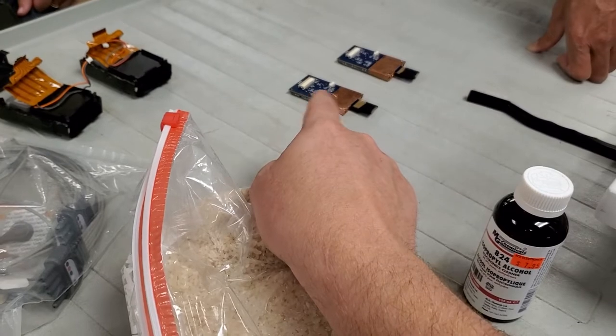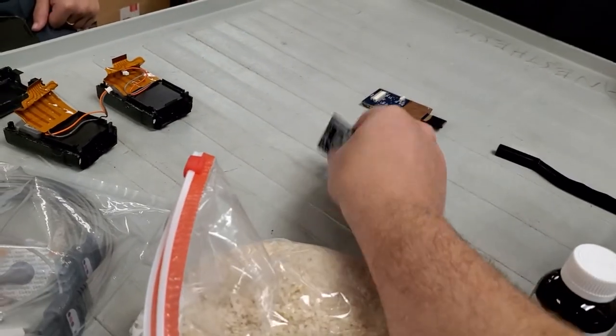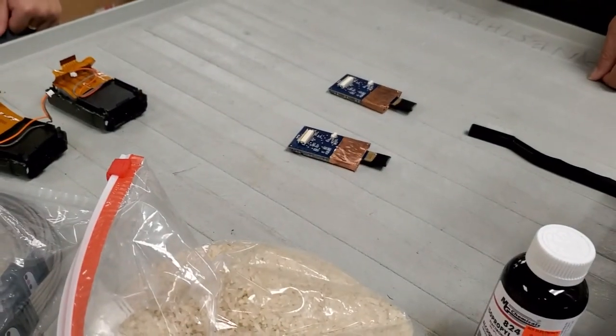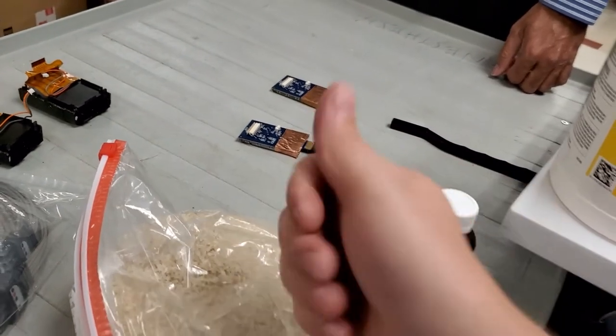Shake out the extra alcohol after you're done, then heat it up past 40 to 50 degrees C so that it evaporates all the alcohol off the board. It gets the moisture underneath the IC chips and you're good to go.